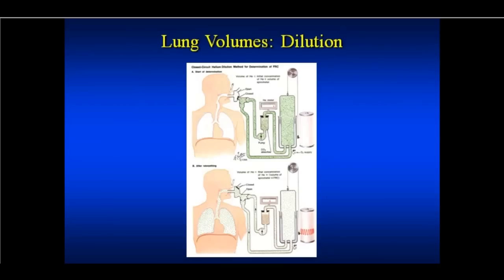All right, so this is the first technique that one can use. I've actually never seen it used. I've only read it out of textbooks. But it's very simple and very straightforward with the helium dilution. You have your system here. You have a Bell spirometer here. You've got your circuit. And you know the density of the helium here, the concentration. Valve is closed. You open the valve and just ask the patient to breathe in and out.